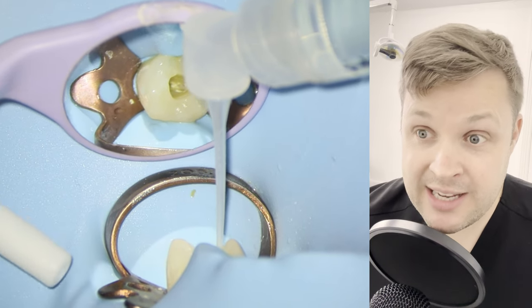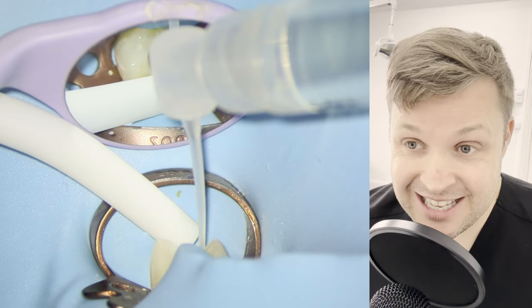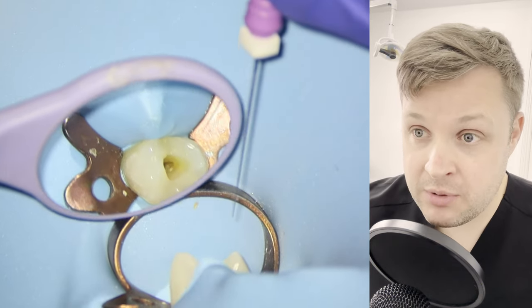There's an argument to say that when you're dressing a tooth, you don't go looking for the canals. He says not to get down the canals — you just want to dress the pulp chamber and let it go.